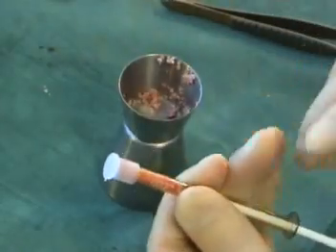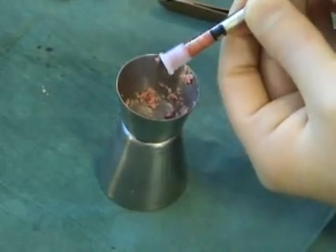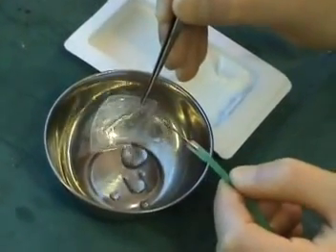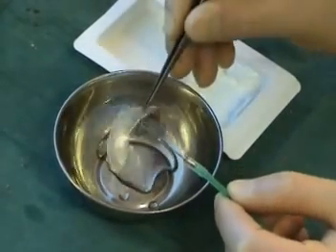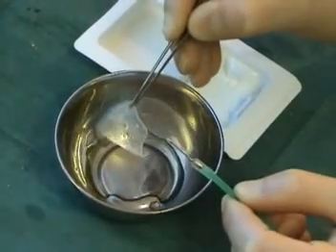Excess moisture is then removed and the graft can be put to one side ready for use. The plasticizer has been allowed to diffuse in the membrane for about 10 minutes. It is then rinsed with sterile water and the membrane will then be ready for use.